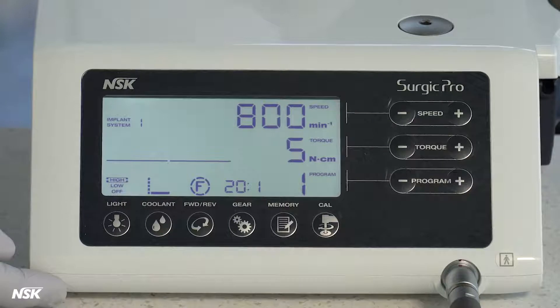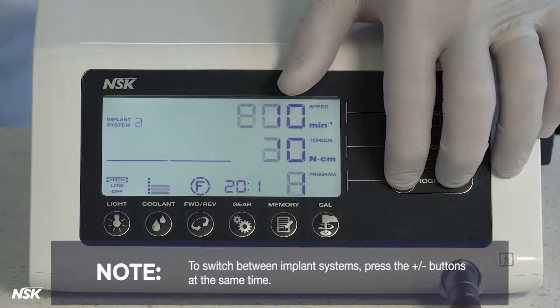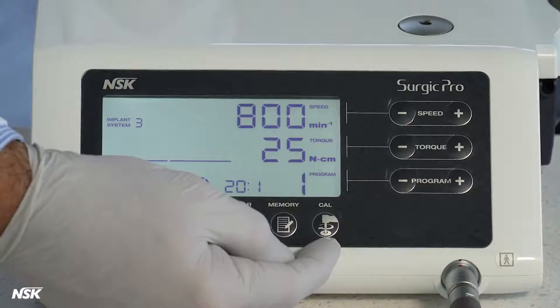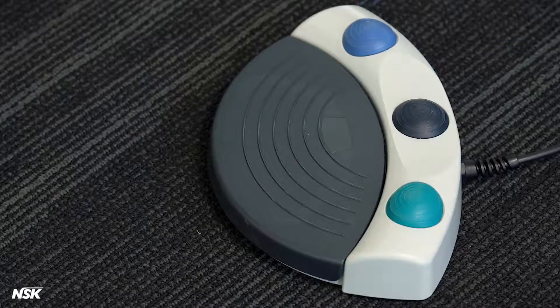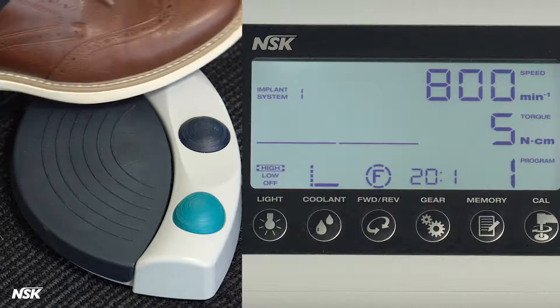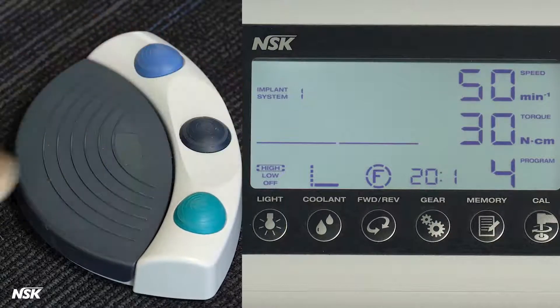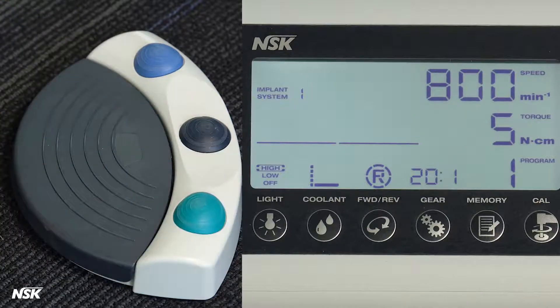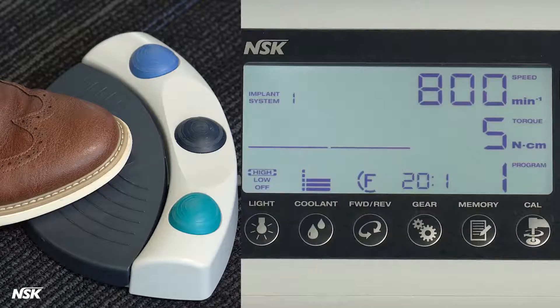You can store up to eight programs for eight different implant systems. To switch between implant systems, press the plus or minus buttons at the same time. The Cal button is used to calibrate a new attachment. Your Surgic Pro can also be controlled by the included foot control to avoid touching the panel during a procedure. The foot control allows you to choose the program number, change the irrigation flow, and switch between forward or reverse direction. The blue button adjusts coolant flow, the black button shuttles between preset programs, and the green button flips between forward or reverse. Note: you will hear beeps when the micromotor is set in reverse direction. The speed control pedal runs the motor.